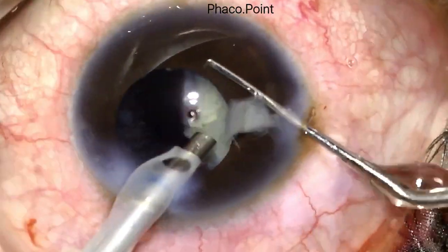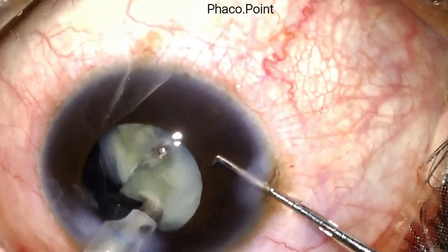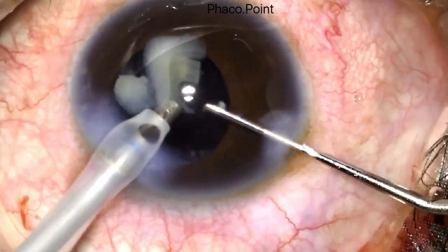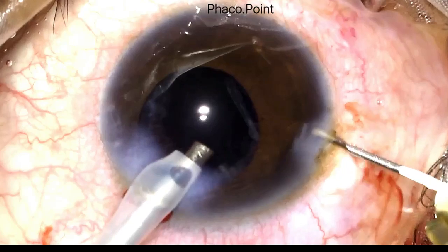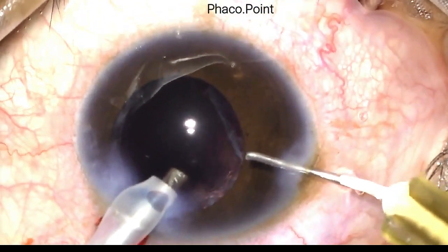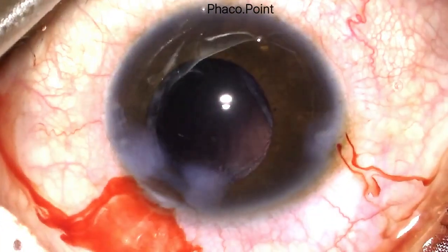The fragments are emulsified one by one. The last fragment is impaled — it is quite large, so it is downsized on its way up and then emulsified successfully. At the end of nucleus emulsification, I perform a viscofluid exchange prior to removing the phaco probe from the eye. Under higher magnification, I am happy to confirm there is no extension of the tear into the posterior capsule.